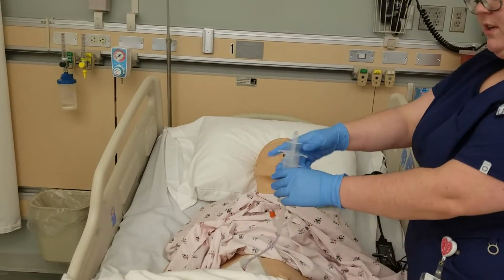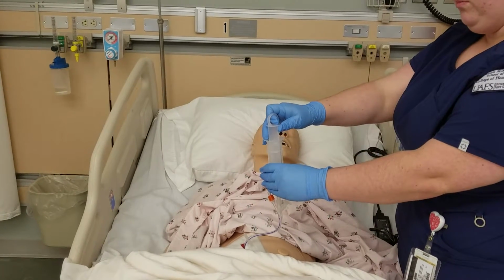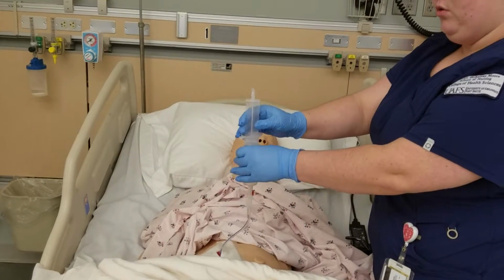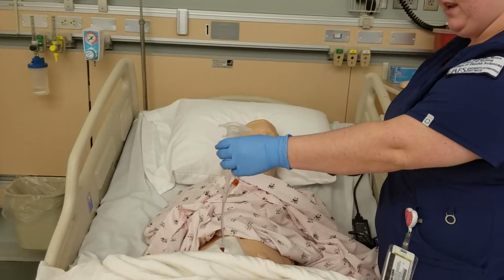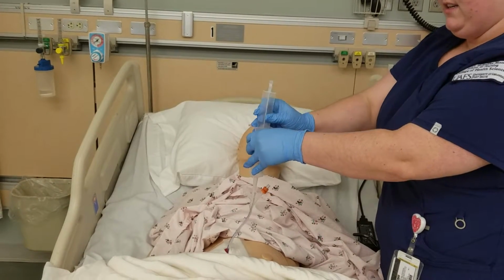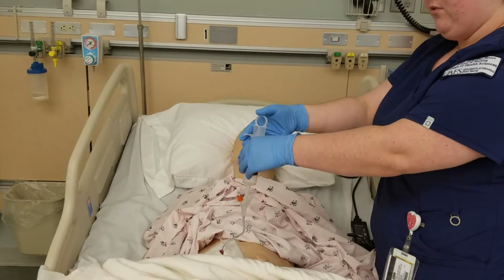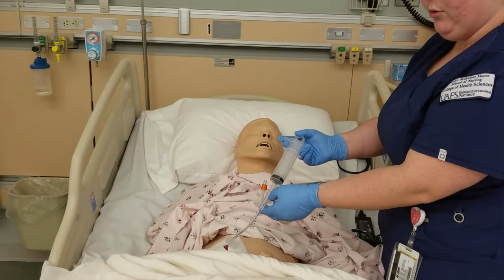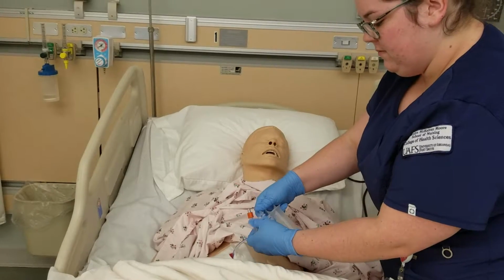Then you can administer the medication one of two ways. You can either do it by gravity, which is where you pull the plunger out slowly and you hold it up and let gravity administer the medication, or if I hadn't done it that way, I could slowly push the medication. Also noting that before you give medication through a PEG or an NG tube, you want to make sure it is at room temperature. You don't want it to be cold or hot when you administer it.